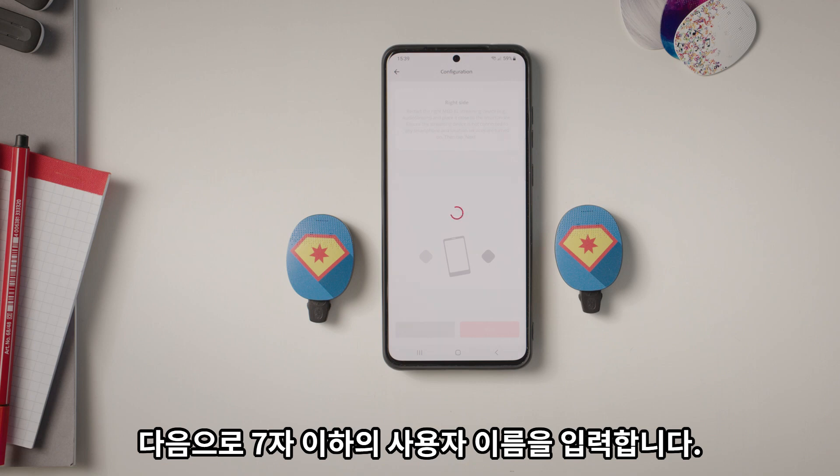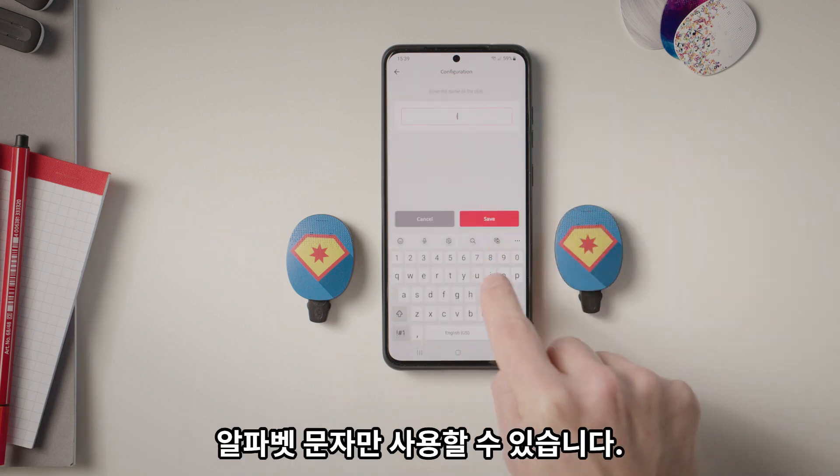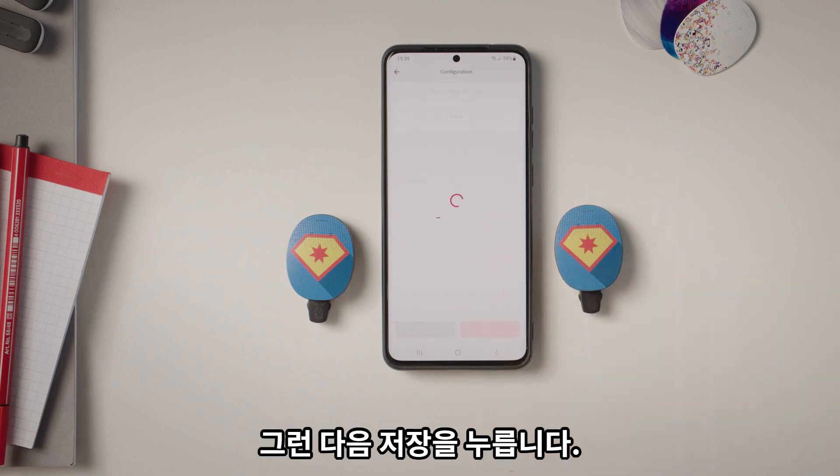Next, enter a username with seven or fewer letters. Only letters from the Latin alphabet can be used. Then tap Save.